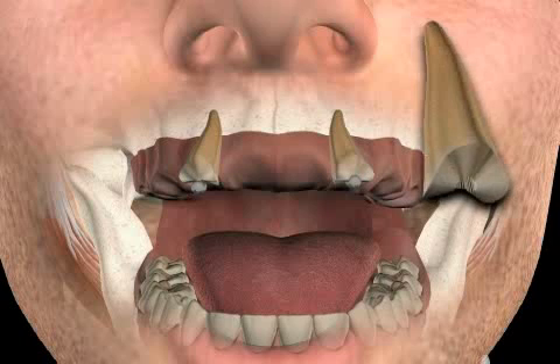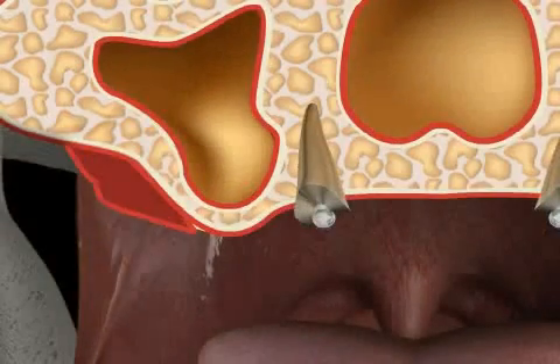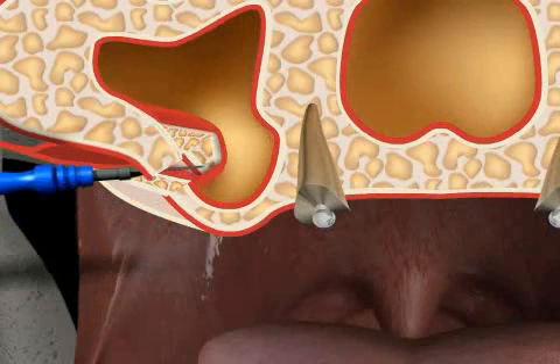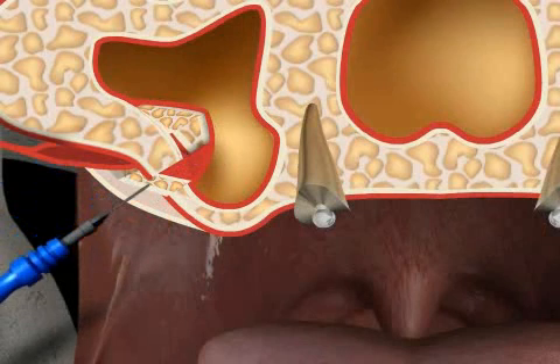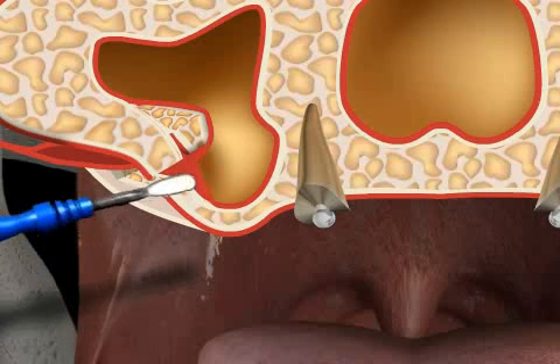In the video, you see a patient who, with the exception of two roots, no longer has any teeth in the upper jaw. Golden caps were fastened to the roots, providing a better hold for the full dentures during the bone augmentation procedure. You will now see an external sinus lift. The oral mucosa has already been lifted to the side, and a small window has been created through the remaining thin bone towards the maxillary sinus.